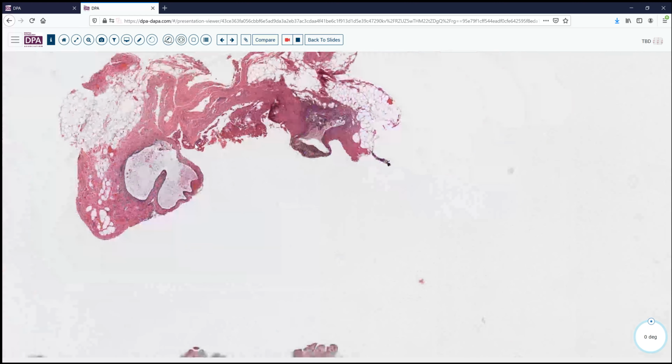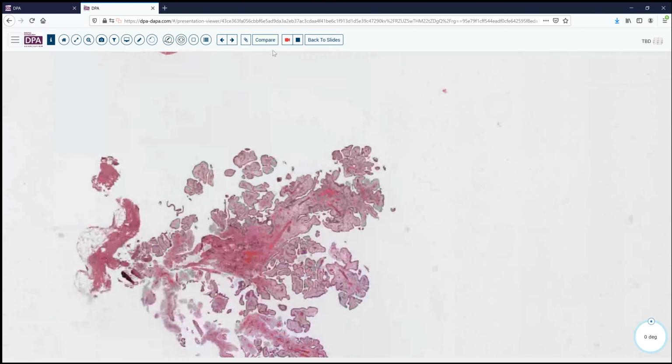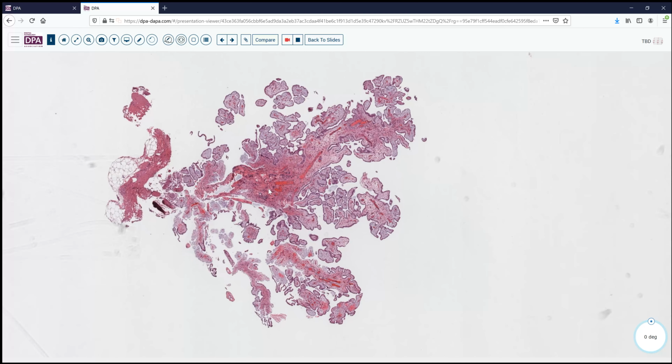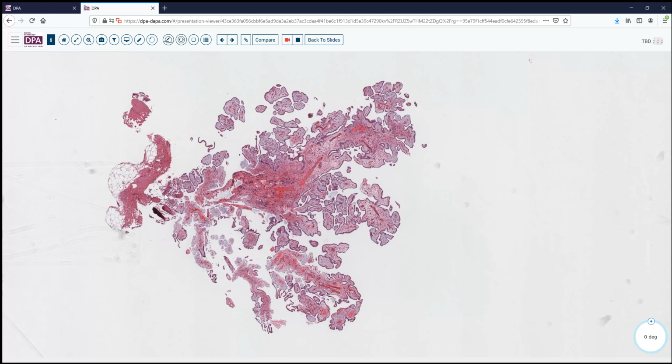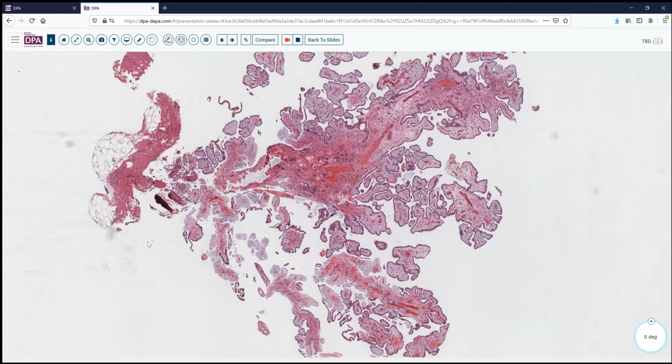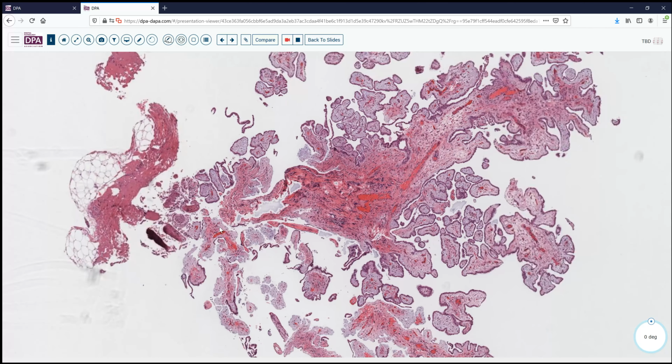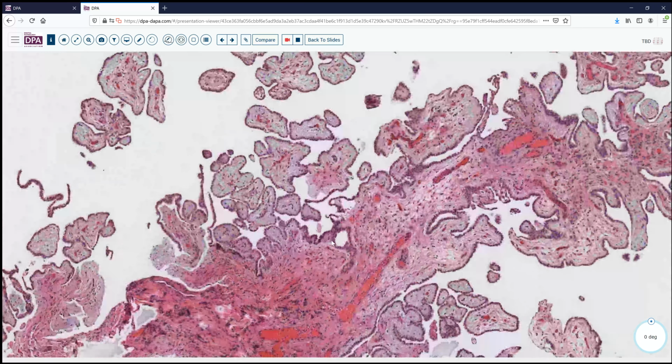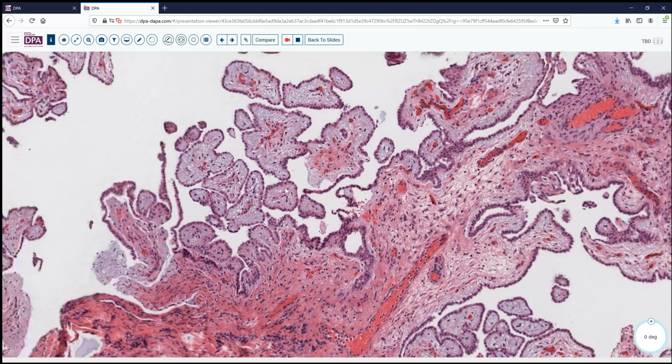But then we also have this tissue that looks like this, a very tree-like structure, papillary branching pattern off of the peritoneum. And of course, most gynecologic surgeons are going to immediately start to think about borderline tumors, serous neoplasms, and so forth with this lesion. So let's take a look at it.